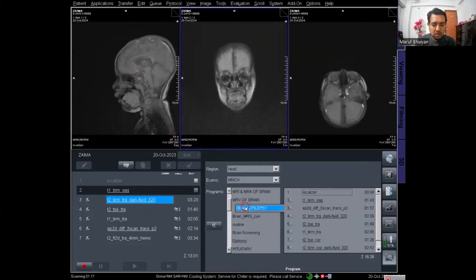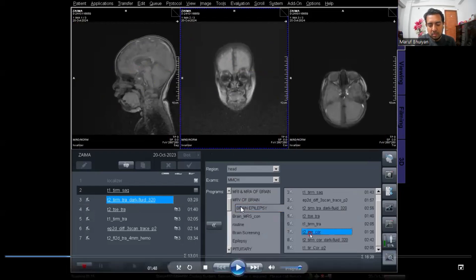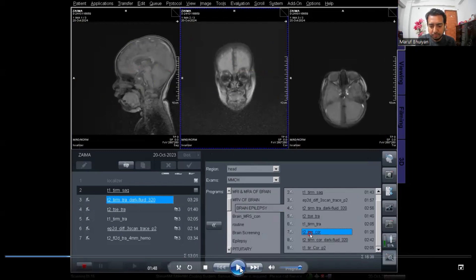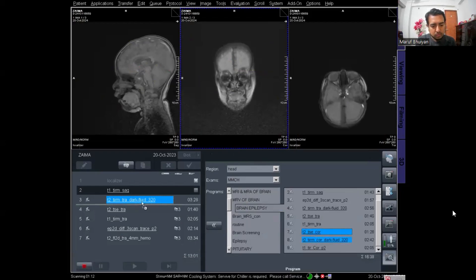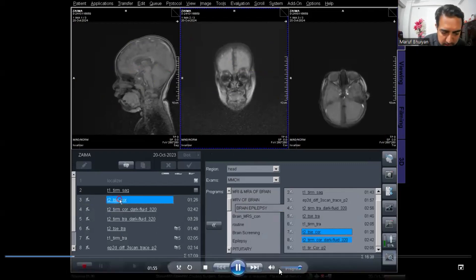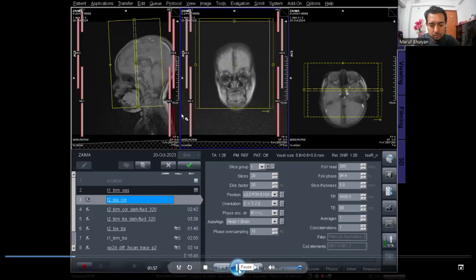From the brain epilepsy folder, I am selecting two protocols: T2 coronal and T2 FLAIR coronal dark fluid. I am dragging these protocols into the exam list, bringing both to my exam list, then opening the protocol and planning the epilepsy protocol.